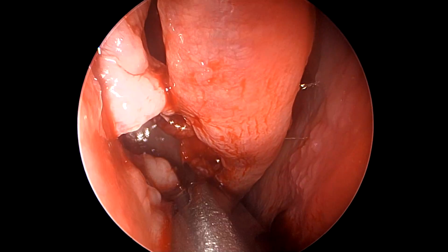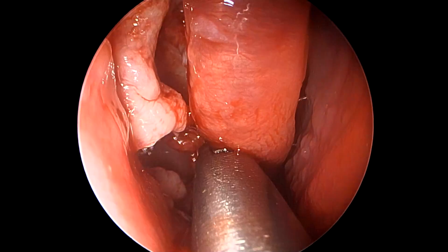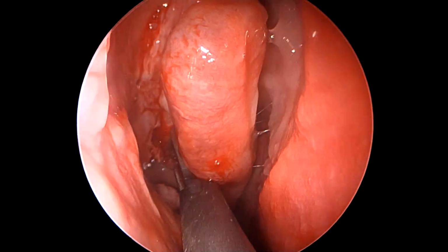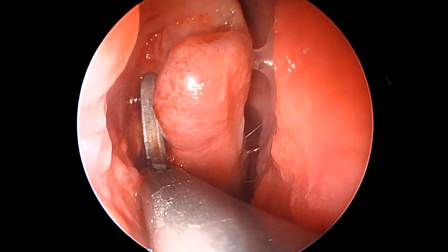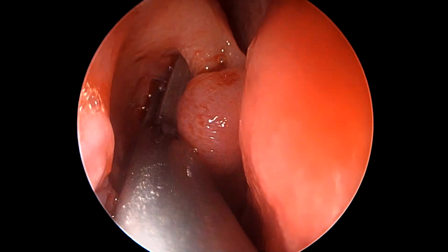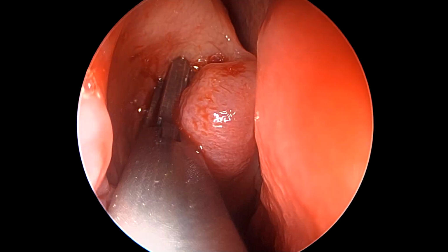Now, the maxillary sinus antrostomy, even if, let's say, it does not have any polyps, is still a very important fundamental procedure because it opens the osteomeatal complex, and also because a large, reasonably made maxillary sinus antrostomy is a very important landmark for our orientation towards the posterior and anterior ethmoids and the sphenoid sinus.